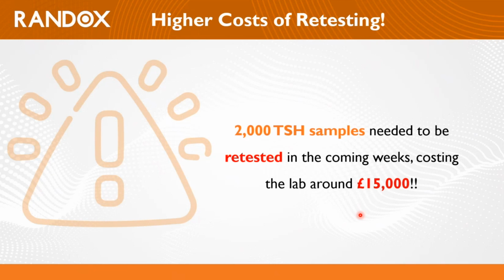So this is a very good example of how matrix issues, issues in calibrators, and issues in reagents can be identified by third-party controls better. And how, if there is an issue in the calibrator, the first-party control will not be able to identify the issue in that calibrator because they're made from the same material.